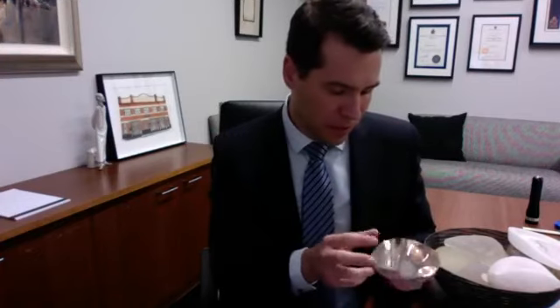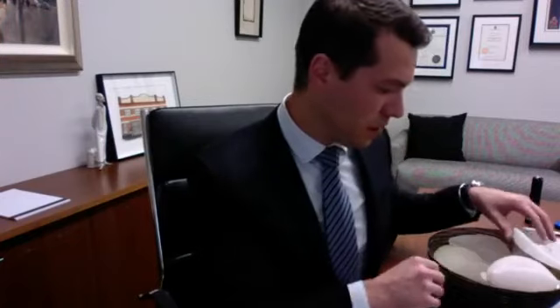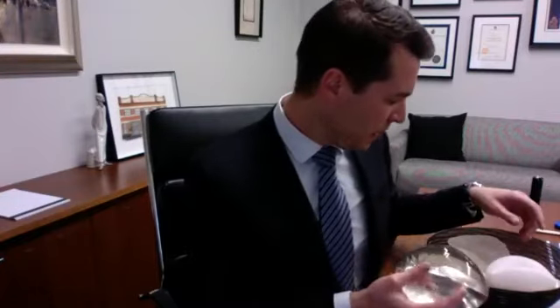My American colleagues, they all love smooth implants over there. They don't understand why we would use textured, but yeah, they like the smooth ones, and a lot of them are finding that that's a good implant. I myself, this is pretty full. It's one of those things where I'd probably say to the patient who wanted the upper fullness of an upper pole, that might be a go. It certainly would be something where if someone said, I want a nice natural slope, it probably wouldn't so much. But again, I don't have a lot of experience with that one yet because it is so new.